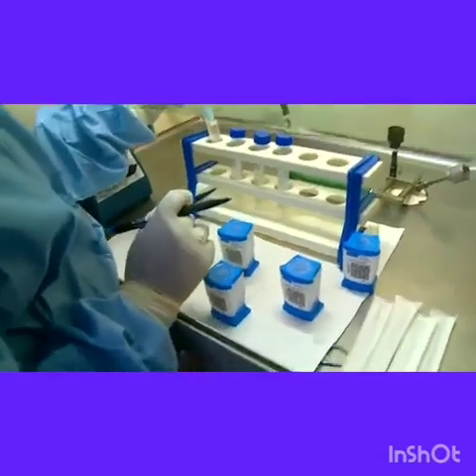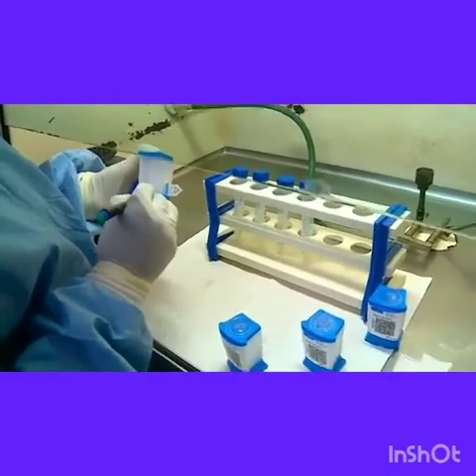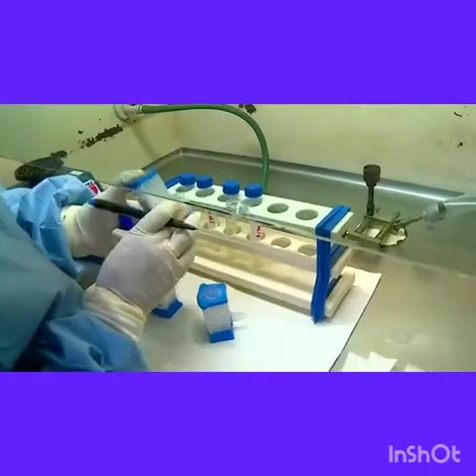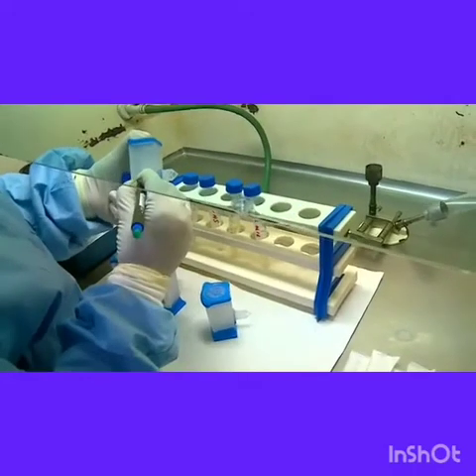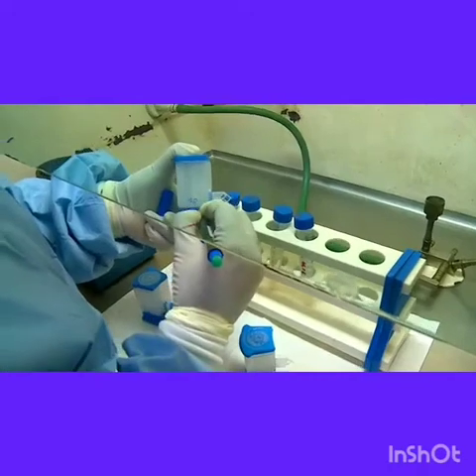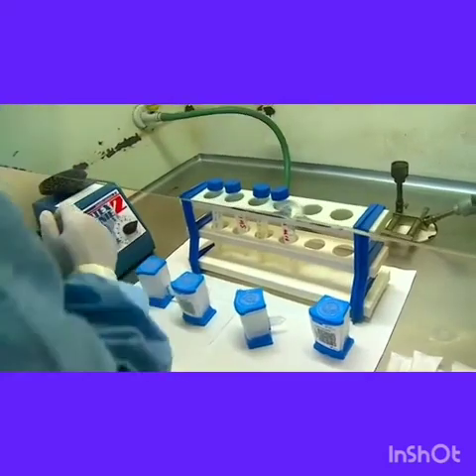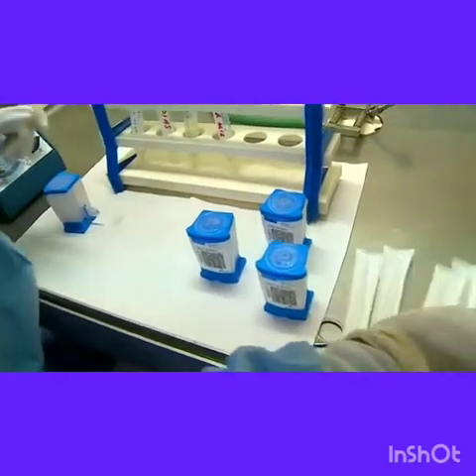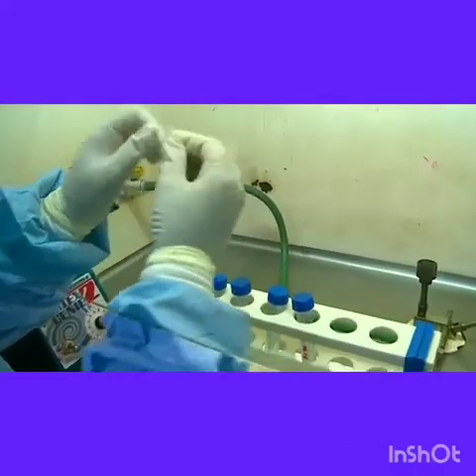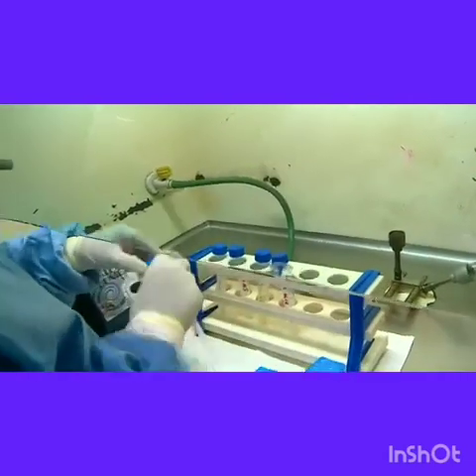The tubes are labeled with a lab number, and once all the cartridges are labeled with the lab ID, the samples are loaded onto the cartridges. About 2 ml of the homogenized sample has to be added to the cartridge, and this is done using an independently packed Pasteur pipette.